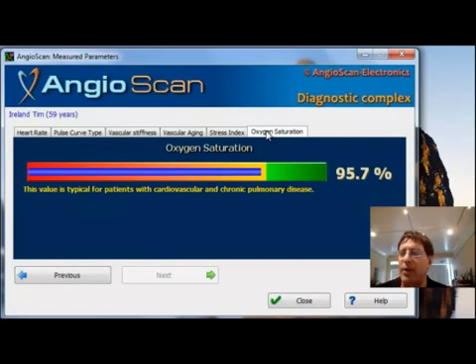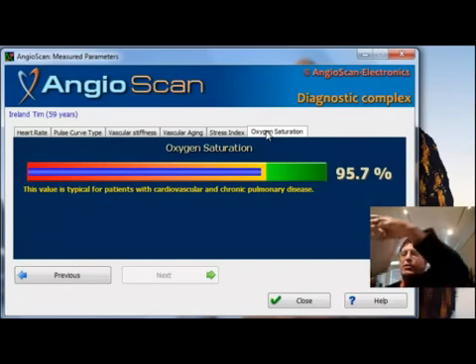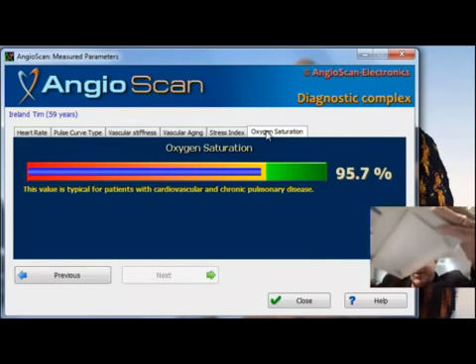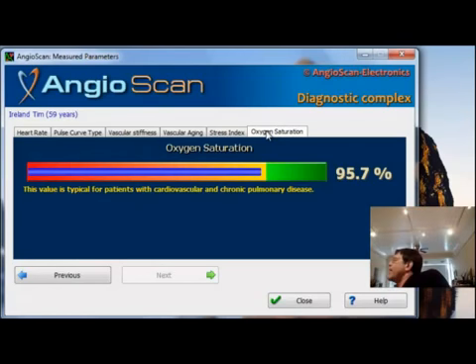So this is just a great little tool that can screen our patients, and it's just a little tiny thing like this that we hook up to the computer, and it's very small. Put it on the person's finger. We're going to go through that later when I go through the tutorial, and it's just super easy to measure. And it's much easier to measure than some of the other things that we have because of the microprocessing and technology today. This is what I used to use in my office. It's hard to see it, but it's just this huge device, hard to put on, and I don't have to use this big, huge device. I can just use this pulse oximeter device to measure, and it's fantastic.